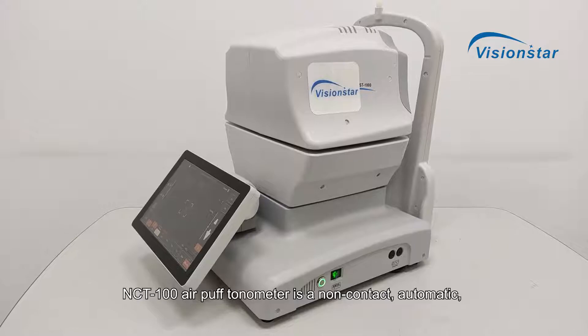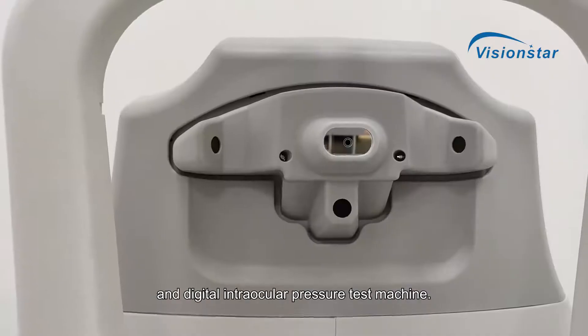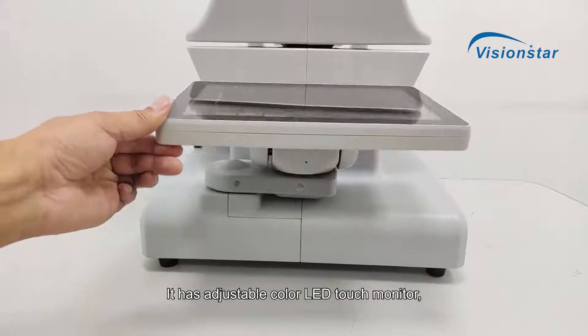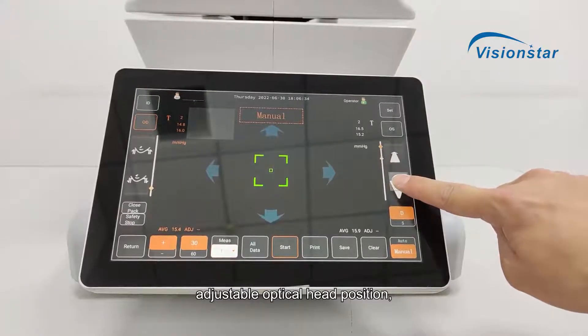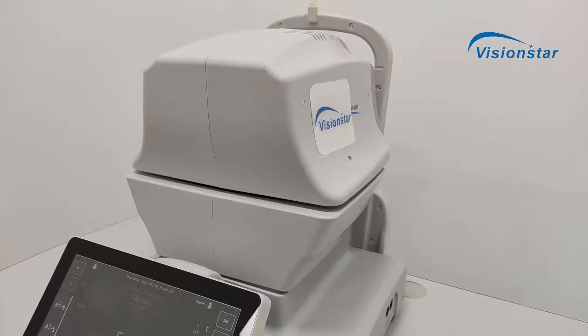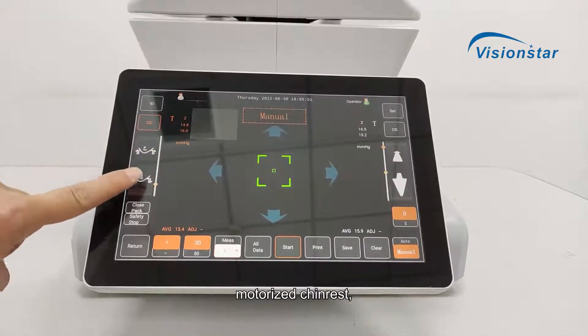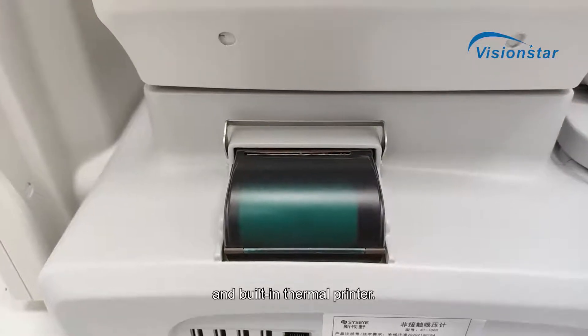NCT100 AirPuff Tonometer is a non-contact, automatic, and digital intraocular pressure test machine. It has an adjustable color LED touch monitor, adjustable optical head position, motorized chinrest, and built-in thermal printer.